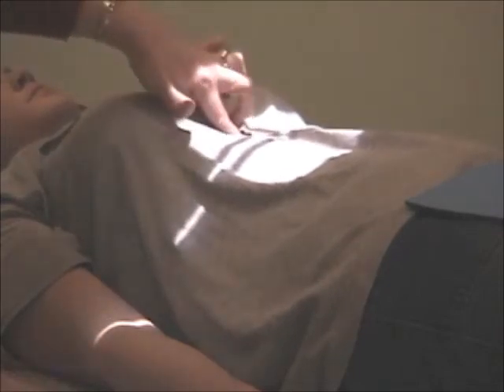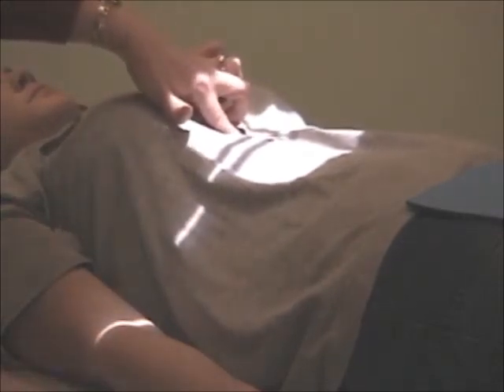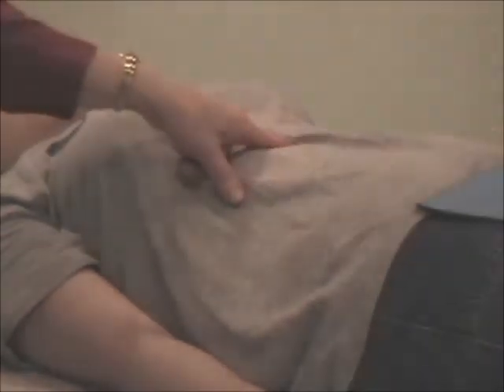If she was hypersthenic, we'd be level with the xiphoid. This is sthenic, 1 inch below the xiphoid. Hypersthenic is 1 inch above the standard line, which is actually right at the xiphoid. And then hypo is 1 inch below, and asthenic is 2 inches below the sthenic mark. Okay. On somebody who's very thin, they're not going to be very wide. You're probably going to be centered right at the midline because you're going to be showing x-ray tabletop over there. Again, you adjust for different body habituses.